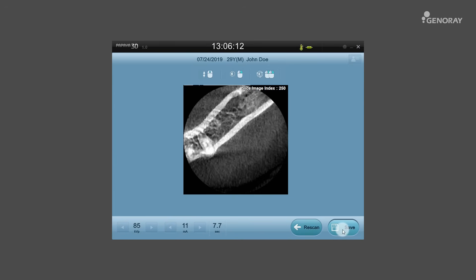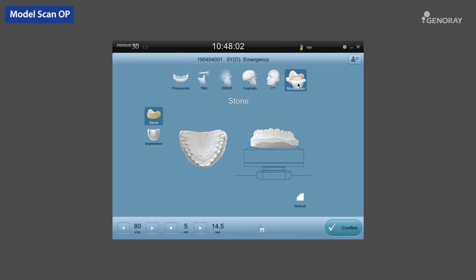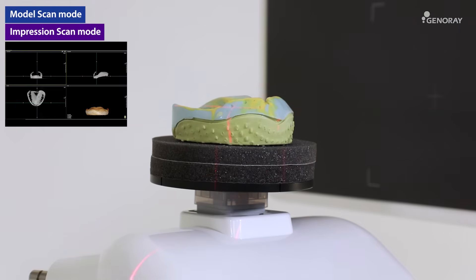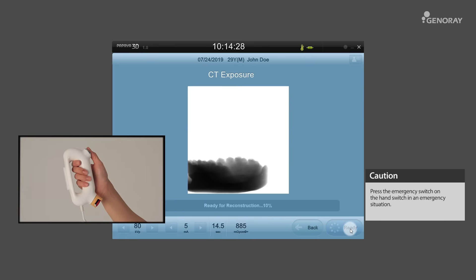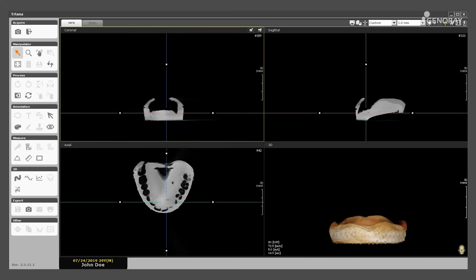When the scan is complete, select the Save button and then use Triana to review the images. Next is the model scan exposure mode. It is possible to extract STL data through scanning a stone model or impression. Once the scanning is ready, select the Ready button on the OP and follow the instructions on how to hold the hand switch down until the exposure is completed. When the scan is complete, select the Save button and then use Triana to review the images.